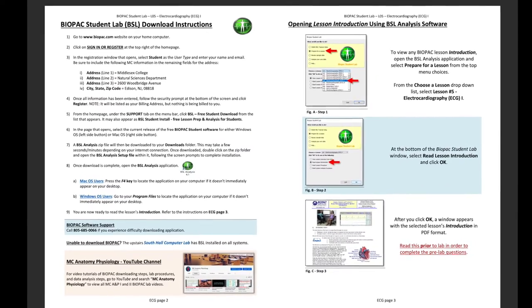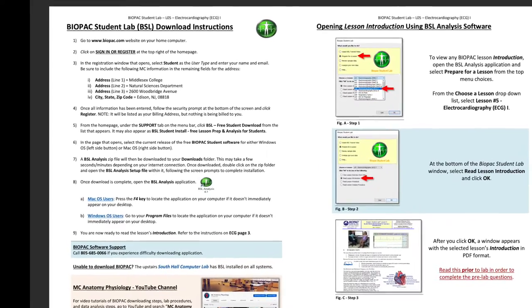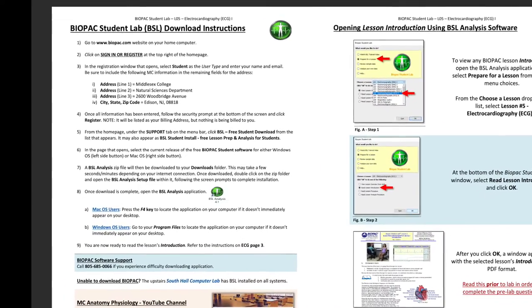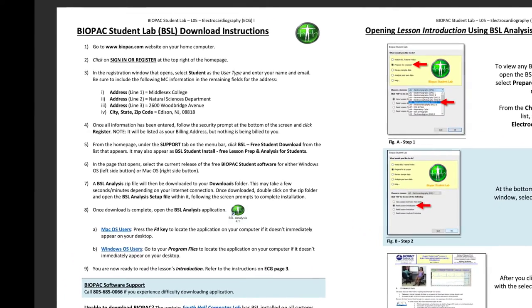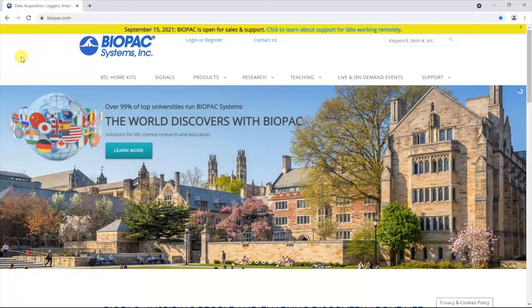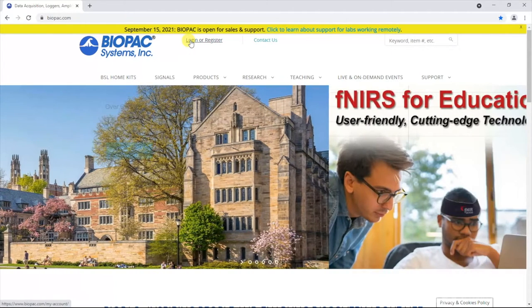Following the BSL downloading steps on page 2 of the Biopac lab instructions in your must-know lab manual, you must first go to the Biopac website. Once there, you must register your download by clicking the login or register link at the top of the home page.